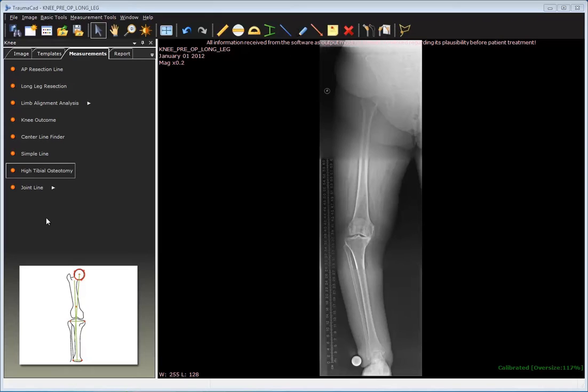The tool calculates the angle of the osteotomy which should be opened in order to create the shift of the axis.